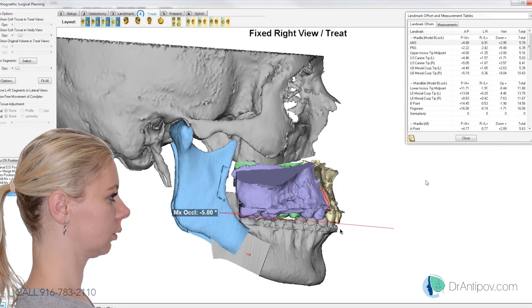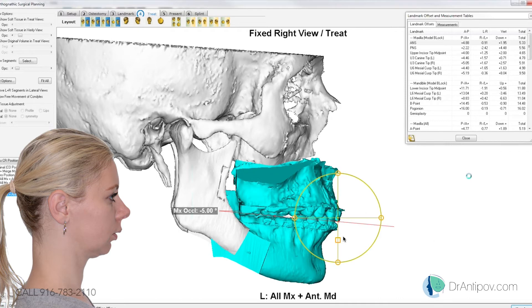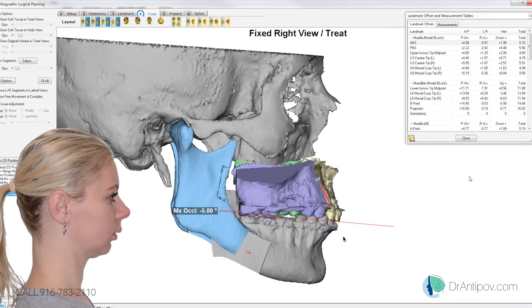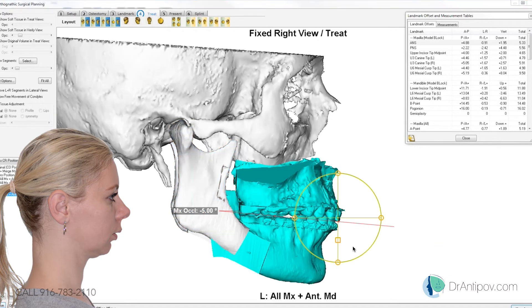Let's do 2 millimeters at the incisal edge instead — let's see what that does. Yeah, 1 millimeter. So coming down 2, we'll bring your right molar down about 8 now. If we do an occlusal change like half a degree back — that gets us to 5.5 degrees.